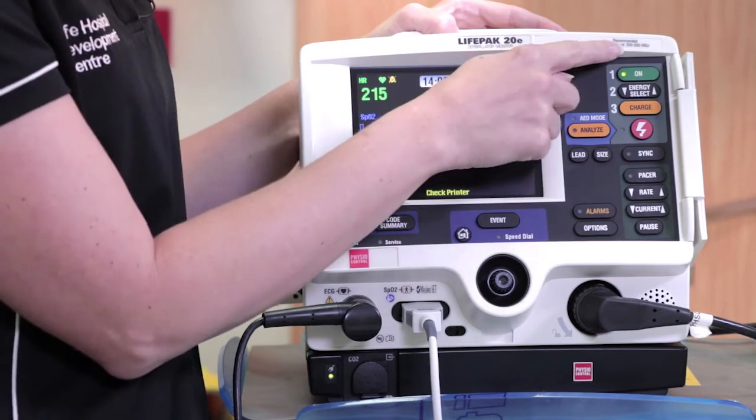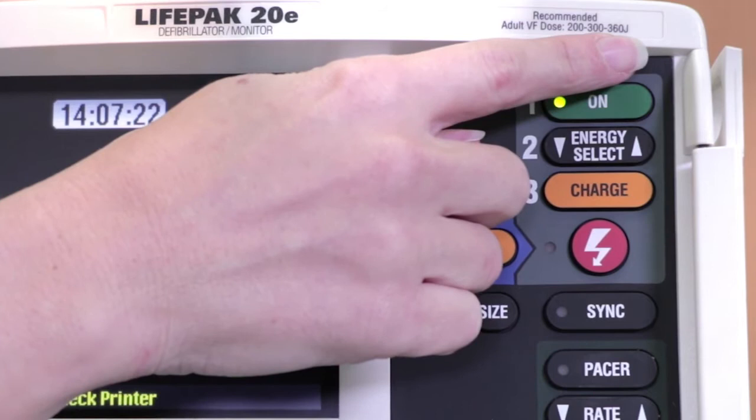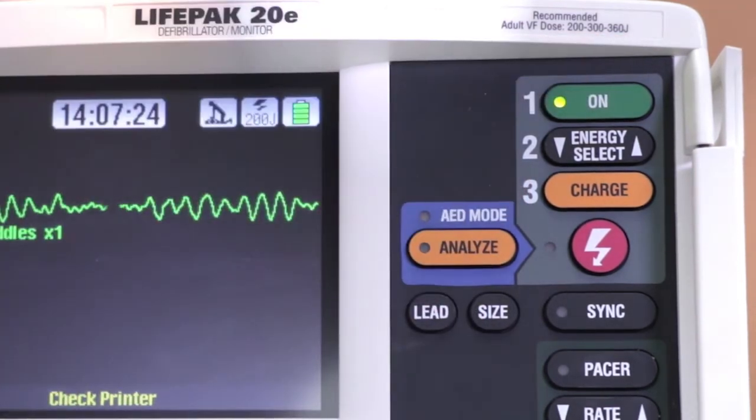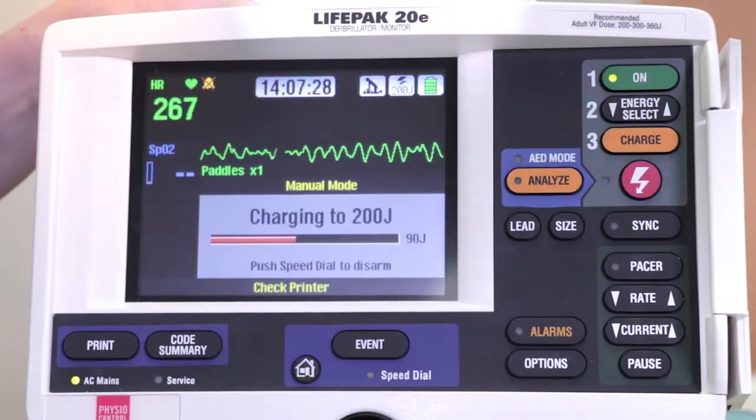Joules are to be delivered as 200, 300, and 360, as per manufacturer's recommendations, which can be found on the small sticker above each panel of your LifePak. Charging — continue CPR.